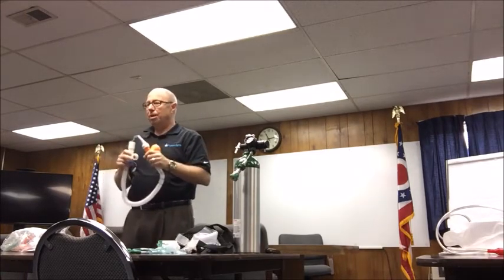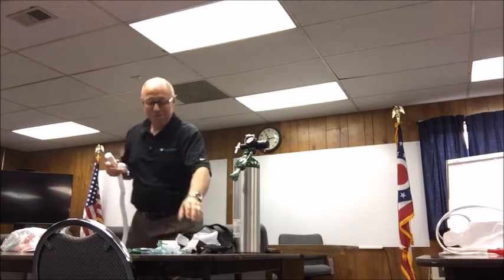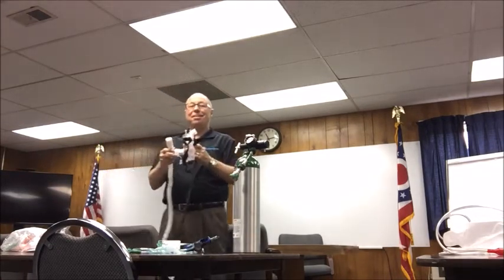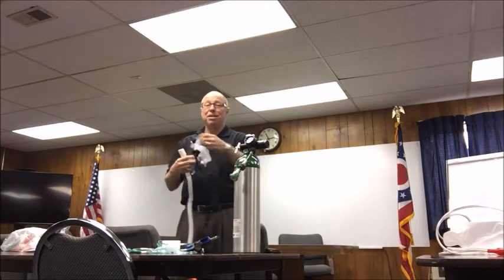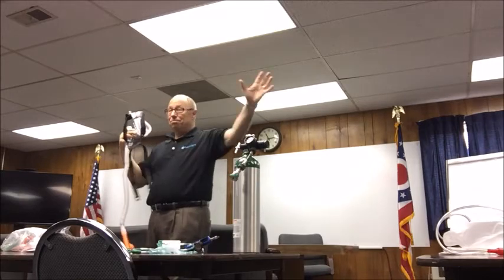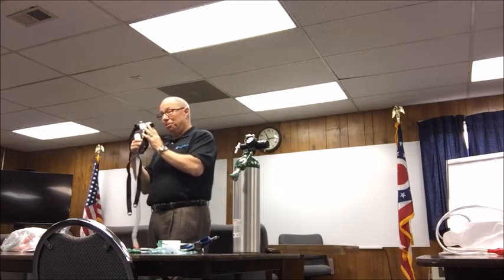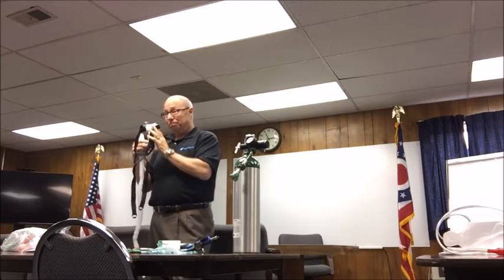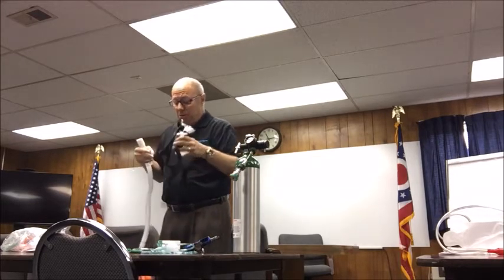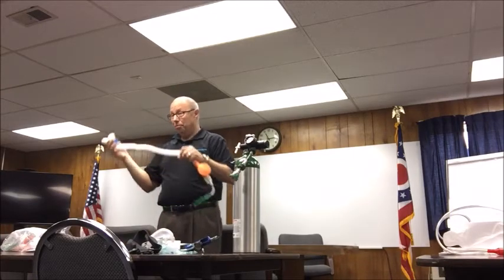I lost my waveform. What happened? Did it get closed? No. Close. Is the mask too tight? Mask is leaking. You have a leak in the mask, and you're getting all that air washing out. So you can use it as a diagnostic tool for a good seal. Okay. So I'm glad you're using capnography, because this and capnography are game changers.